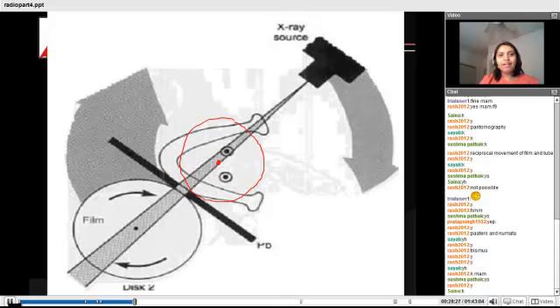But the mandible is not a circle. So the problem here comes with the center of rotation. Normally in OPG there is a shift in the center of rotation so that we create proper images. We'll be talking about how many centers of rotation there are and what effect they cause in probably the future slides.